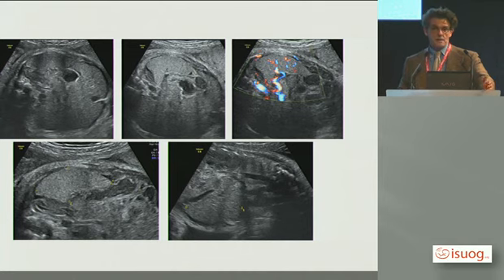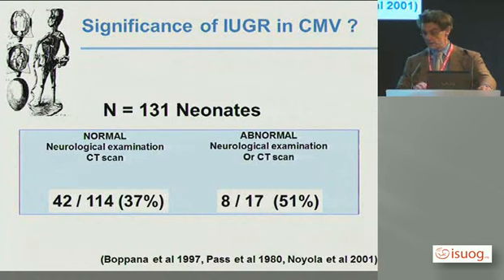But again, honestly, who sees the spleen if you're not looking for it? Usually, nobody looks at it. Very rightly so, most probably.